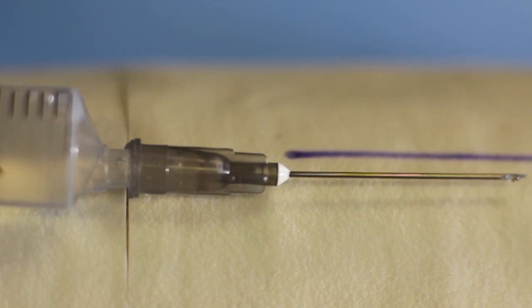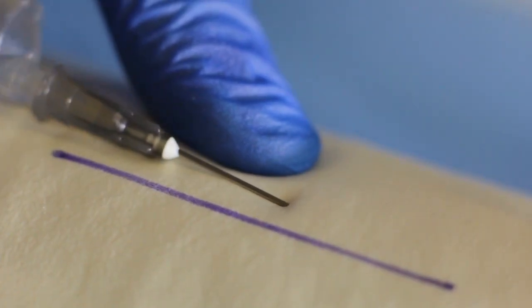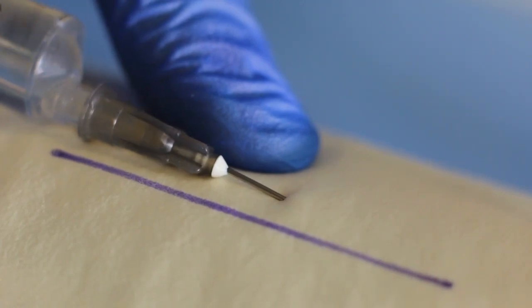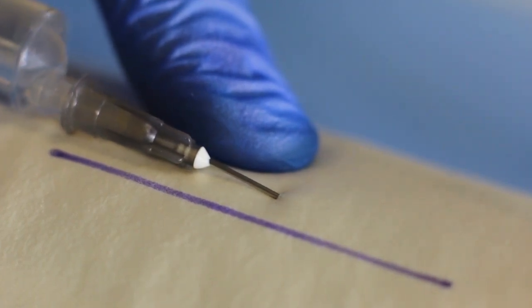If the laceration is longer than the needle, repeat the same procedure along the next section of skin next to the laceration, but ensure that you enter the skin in already locally anesthetized skin.